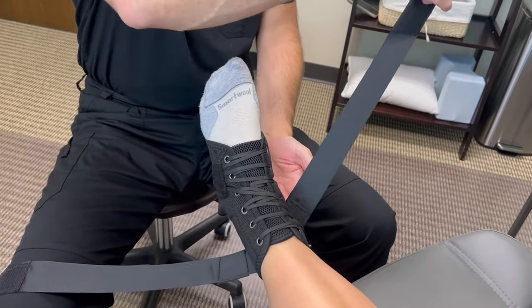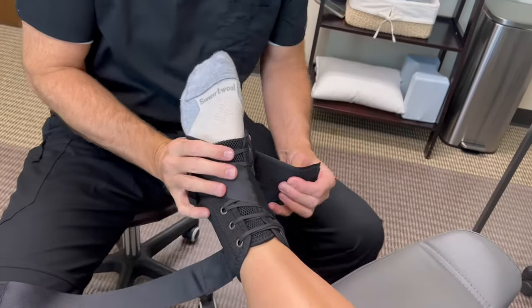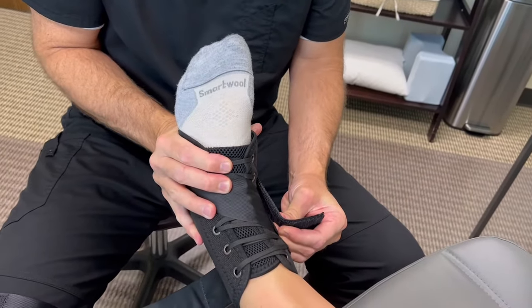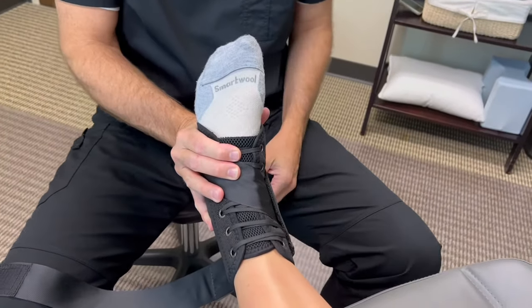So we'll start with this one. It's just gonna go straight across right under the arch, and then you're gonna kind of pull the foot in like that if you're worried about the medial side, and you're gonna stick that on.